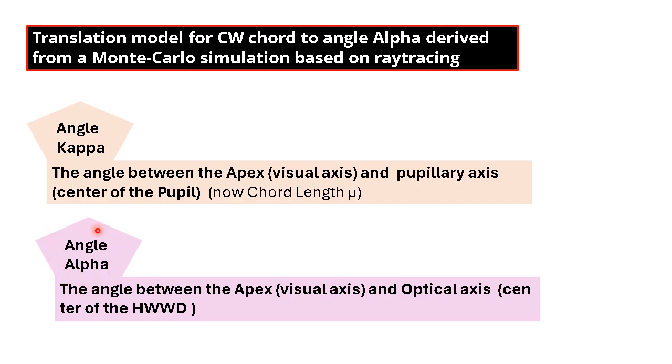And the angle of alpha is gaining importance in the late decades after the innovations of the premium lenses, the enhanced depth of focus lenses, and the toric lenses. They found that for ideal proper centration of the intraocular lens in the capsular bag, the angle of alpha should be taken into consideration.